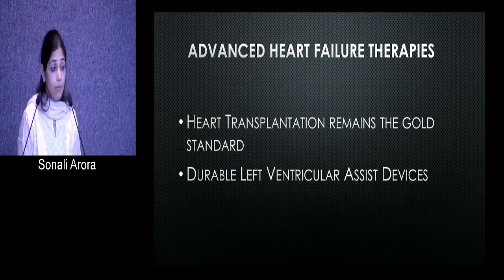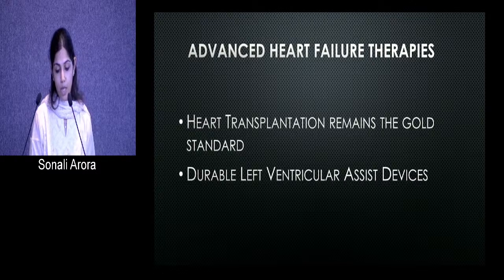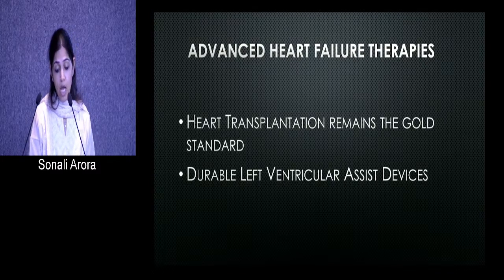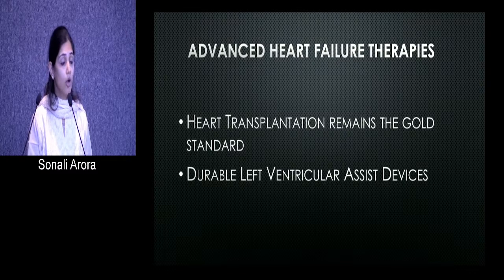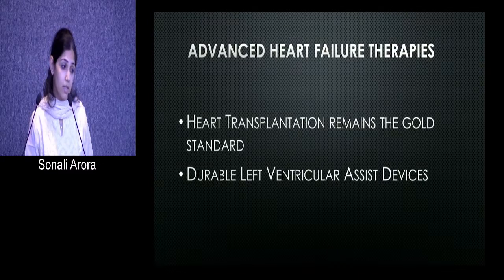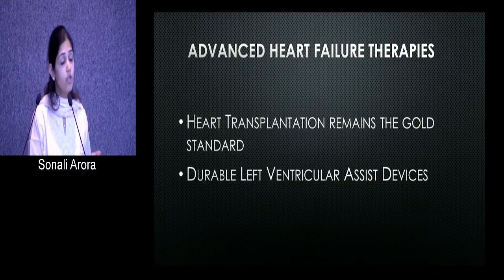So let's come to our second topic. Advanced heart failure therapies: heart transplantation, which remains the gold standard, but I will not be talking about that today. Let's talk about durable LVADs, which will be a treatment for chronic heart failure patients, or an acute heart failure patient who has been on some temporary mechanical support or who has been on inotropes, but we are not able to wean inotropes or wean MCS on them, and then we think about bridge to a durable LVAD.